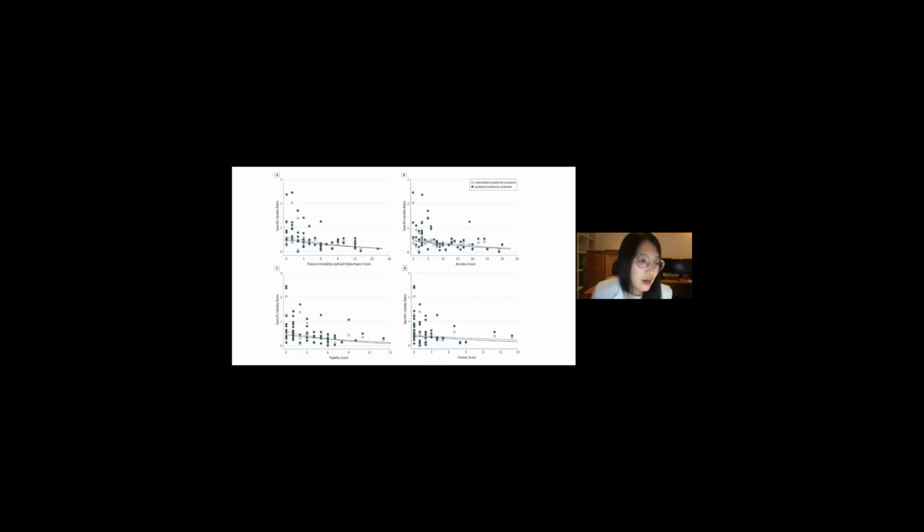This figure illustrates the scatter plot and fitted exponential curve of bilateral posterior putamen SUVR against each subscore of UPDRS motor score for postural instability and gait disturbance, akinesia, rigidity, and tremor. All were with a significant exponential correlation with SUVR except for tremor.